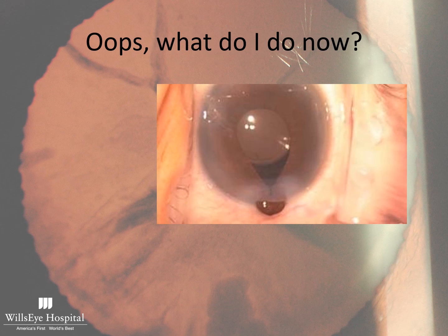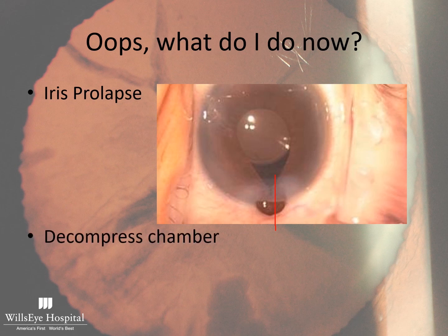All right, here is an example of iris prolapse. This is in a patient with IFIS syndrome. And so, the tendency is to want to shove the iris back in through the main wound, but this is not what's going to help you the most here. What you want to do is decompress the chamber.